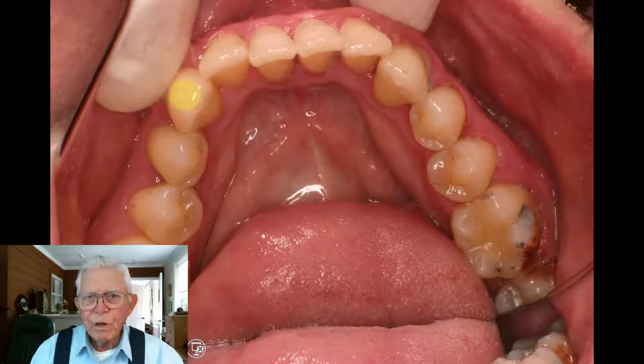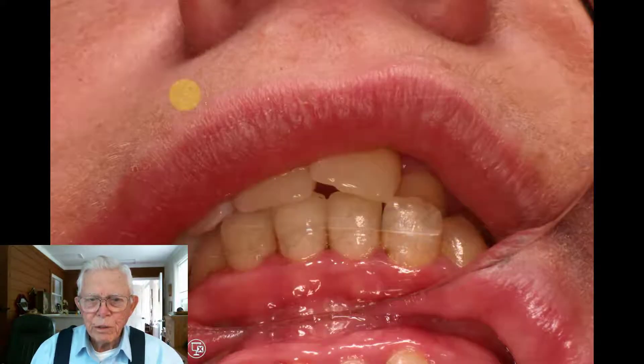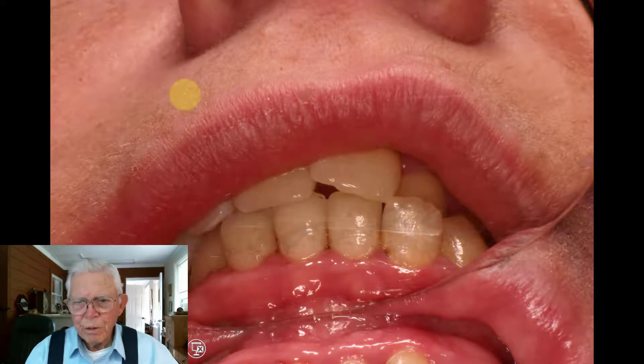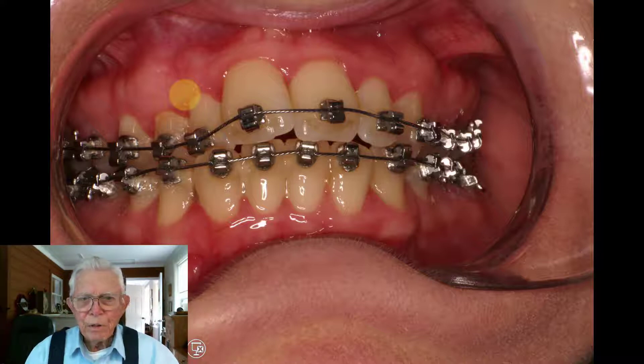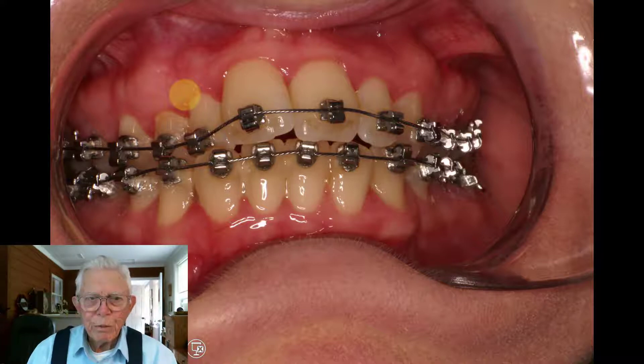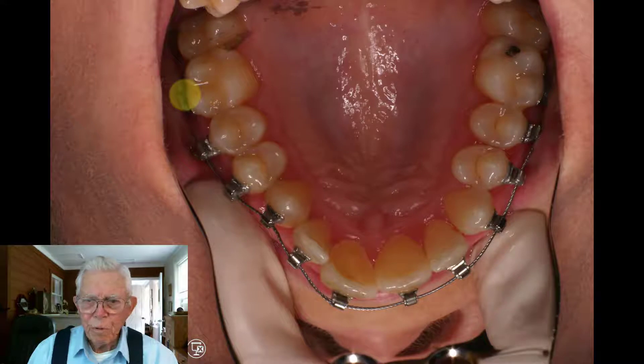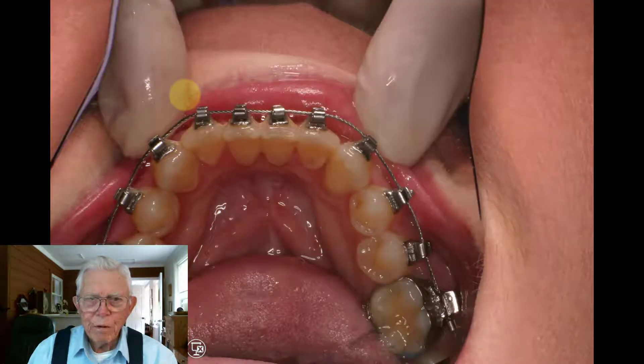The lower arch is kicked off a little bit because of the crossbite — it's deformed too, and we'll correct that. The upper has a little crowding, an anterior crossbite, and some other problems. We started off with a flexible wire, just a regular twisted wire that's real flexible, and put it in there to see what it would do. It would line up the rest of the teeth, but it did not jump the bite. You can see the deformity is still there.